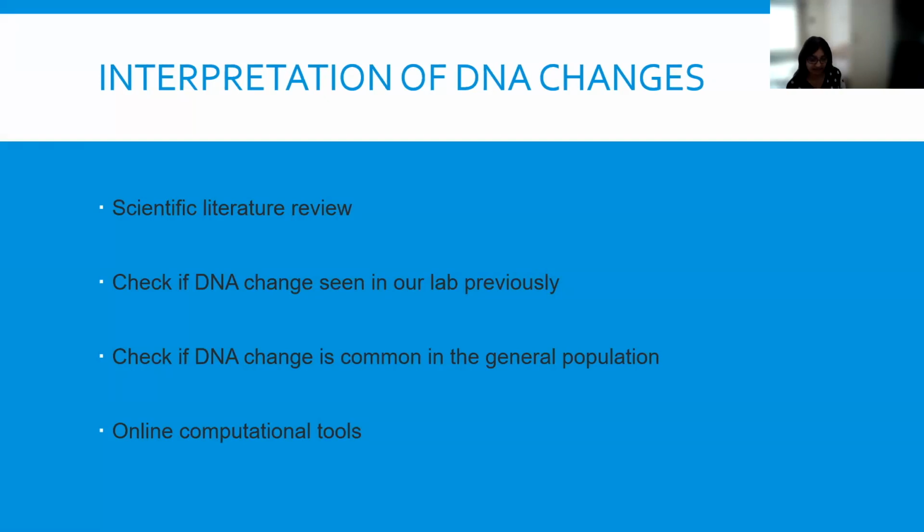Once the decision has been made that a variant in the channel gene is disease-causing, we will write a report to the referring clinician, and this will contain relevant information on the gene change that we have identified. So this analysis and reporting is carried out by one scientist and checked by a second scientist. Then the doctor will give the patient their results in their clinic appointment.